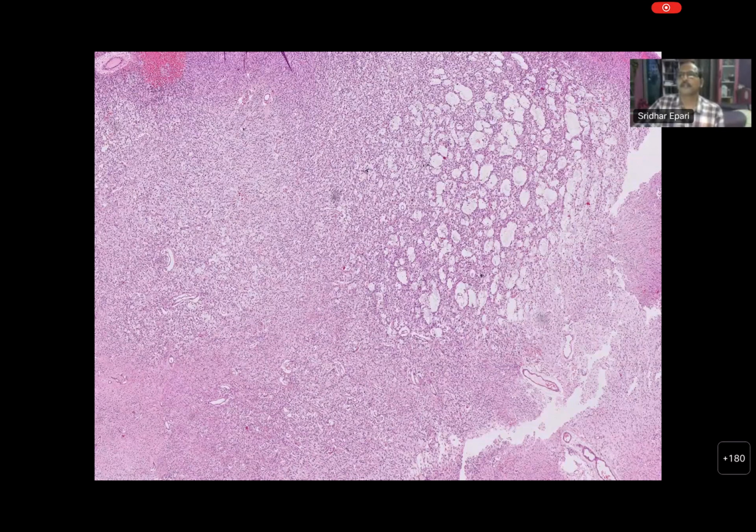It is hypercellular. So you should say at least that you can see a cellular lesion with variable areas. Some of the areas you can say are microcystic, otherwise a relatively compact fibrillary matrix. This microcystic change is what you can pick up in radiology as T2 hyperintensity.